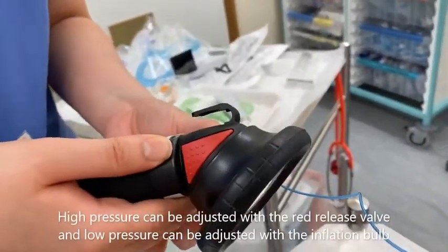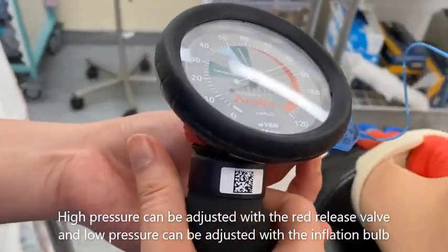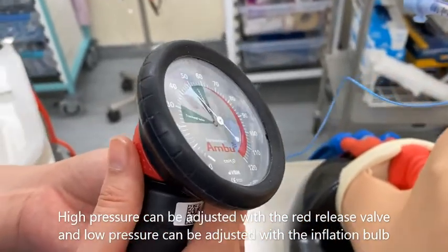Depending on the pressure shown, you can increase the pressure by inflating the bulb at the bottom, or reduce the pressure by pressing on the red release valve at the side.